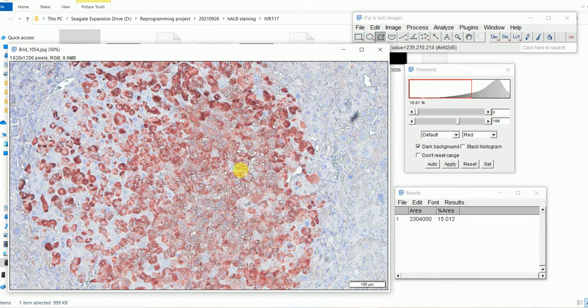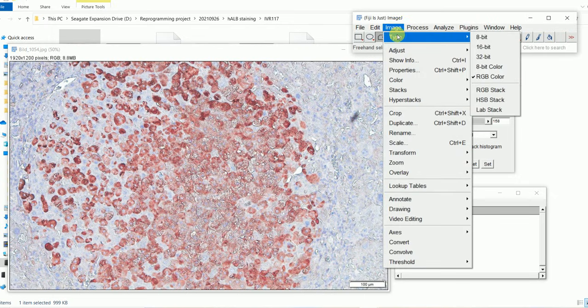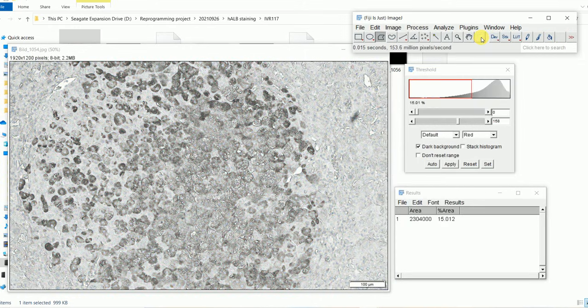So this is another image that I want to quantify. You know the procedure, right? First you will go to image, then type, and then you will click on 8-bit. Okay, you see here it also became positive, and originally it was not positive. If you look at the original image, this was not positive. So I can undo it.